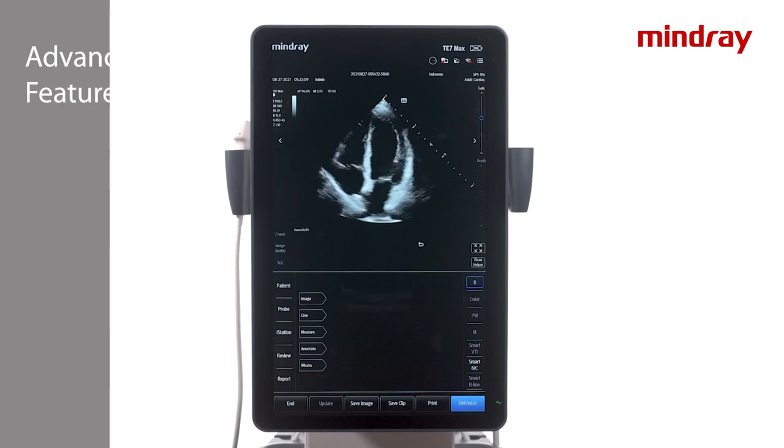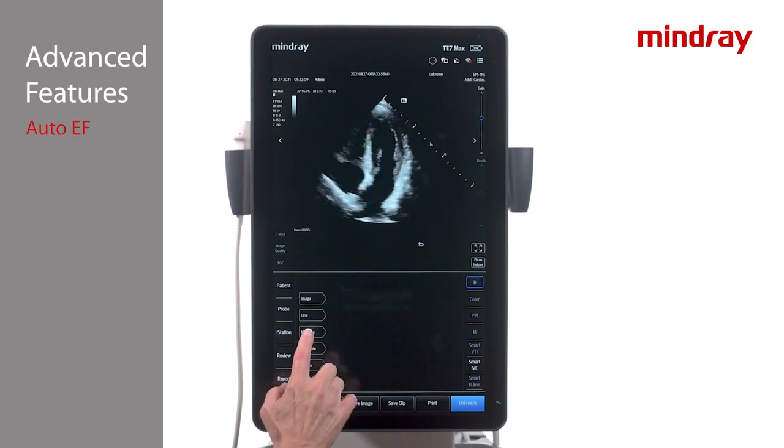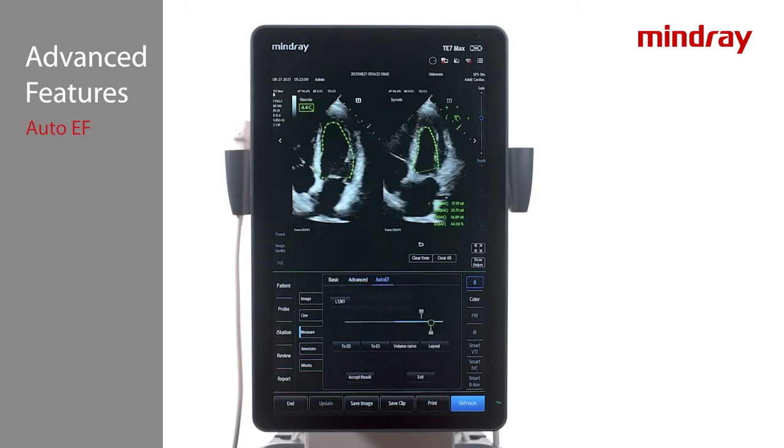Auto-EF is a quick tool that provides left ventricular ejection fraction based on the Simpsons method. Auto-EF can be used either on a saved clip or while live scanning. Using the phased array transducer in a cardiac exam mode, obtain an apical 4 or apical 2 chamber view of the heart. Press Measure, Advanced, Auto-EF. The system will automatically analyze and trace the left ventricular chamber in both diastole and systole, providing ejection fraction and volume data.